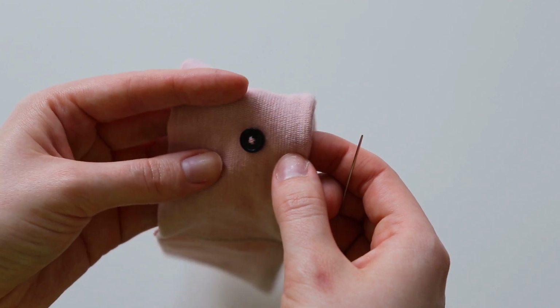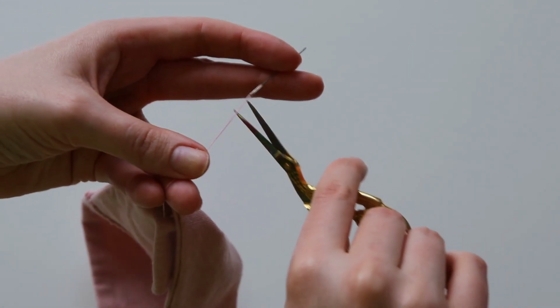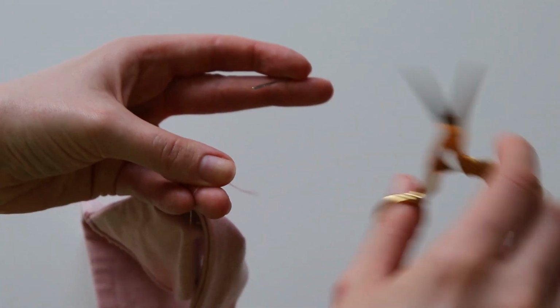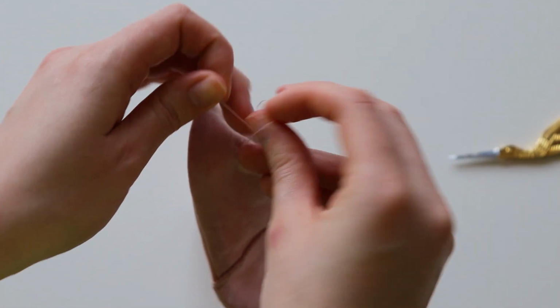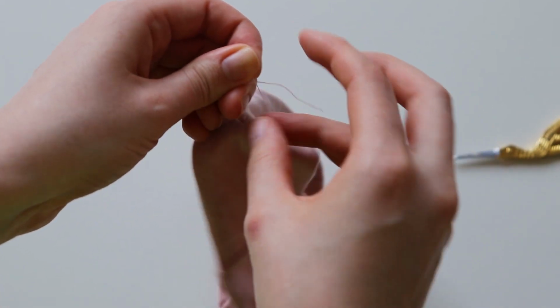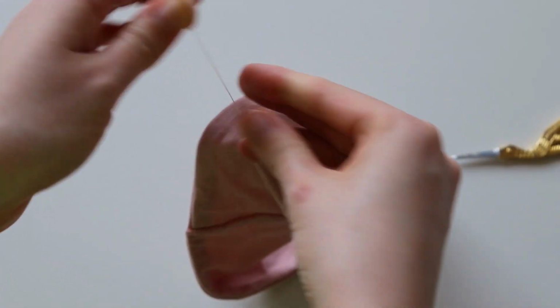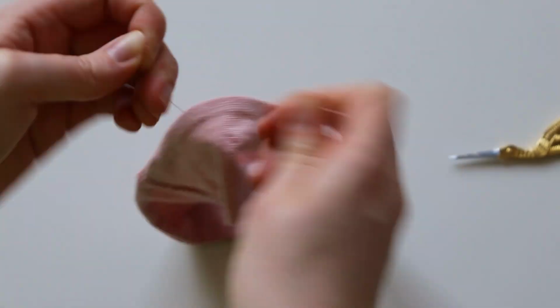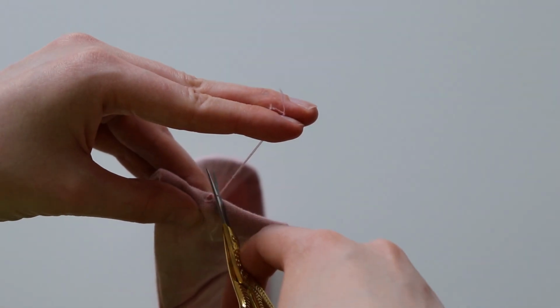Once you feel like that is on there pretty well, what you are going to do is just trim where the thread is connected to your needle. So where it's looped through, just go ahead and give that a little cut, which will leave you with 2 individual threads. What you are going to do now to close this off, this is a really easy way to close your sewing off, is just tie these 2 threads in a simple knot. So again, you are just taking both of these, pulling them, and making a knot. Do this again probably 4 or 5 times just to make sure that it is secure. And then just trim off any excess thread that you have.